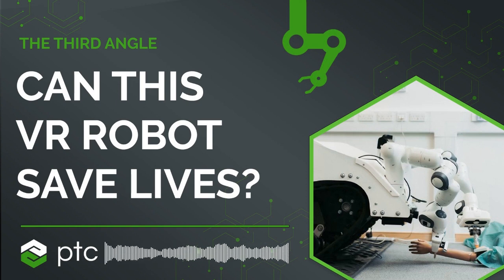So in terms of remotely performing an examination of the casualty's abdomen, that's not an off-the-shelf piece of kit. So we developed something called a TacTip. It was a tactile sensor that would feed information back to the operator, so they could identify any unknown, unexpected objects in the casualty's abdomen, such as shrapnel. You can see there's a soft rubber tip, and as that deforms over a surface, you can build up a remote impression of the surface itself. That was our feedback mechanism, and it allowed us to identify any obstructions or unexpected objects on the casualty.